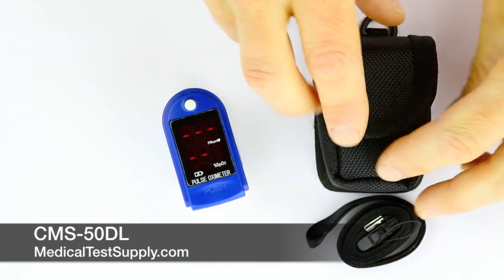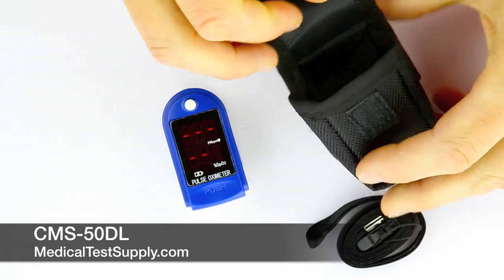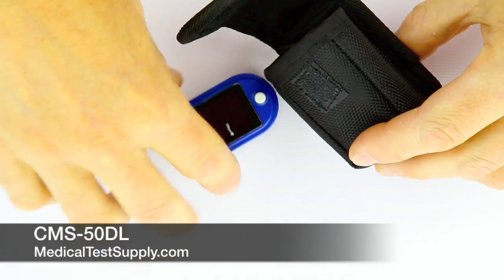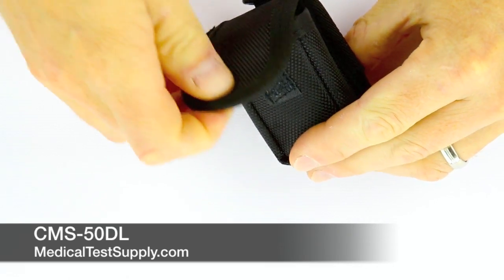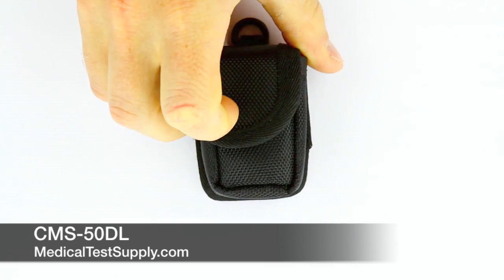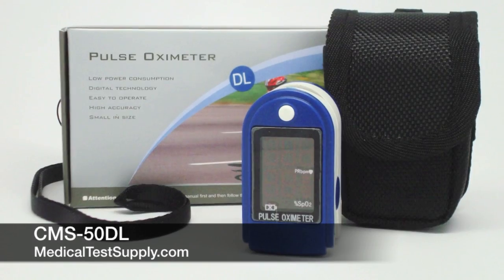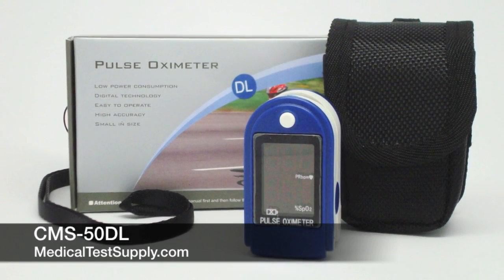Operation is very simple with one button on and off, and the device also shuts off automatically. It requires two AAA batteries to operate and will provide nearly 24 hours of continuous operation. The device is FDA approved and comes with a monitor, lanyard, and case.